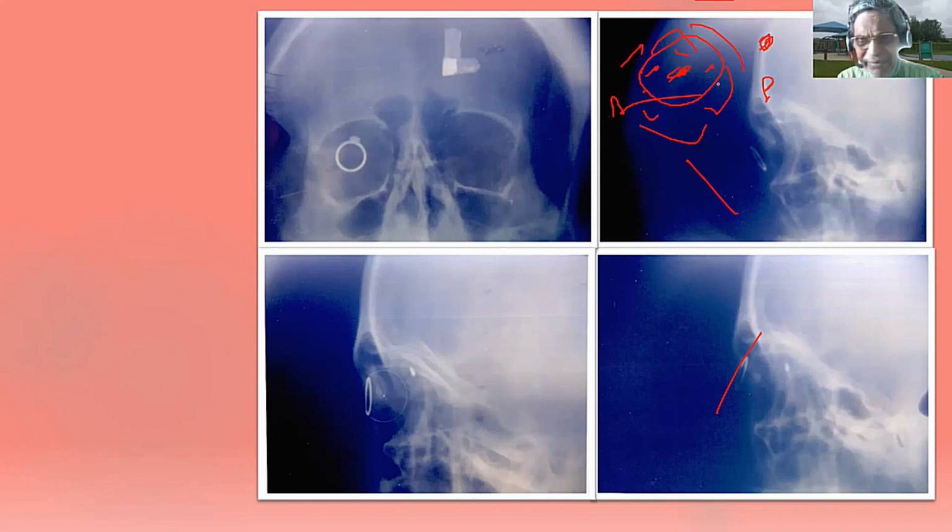Very rarely, during the traversing of that pathway, fibrous tissue can proliferate and get attached to the foreign body. That means when I move, because of fibrous tissue contraction, the foreign body also appears to move. But many examiners may not agree. Just tell that the chance is there.